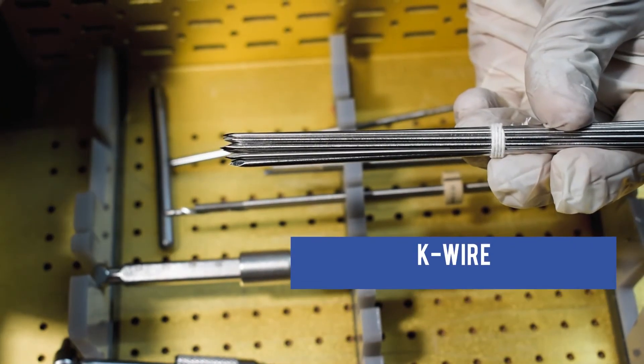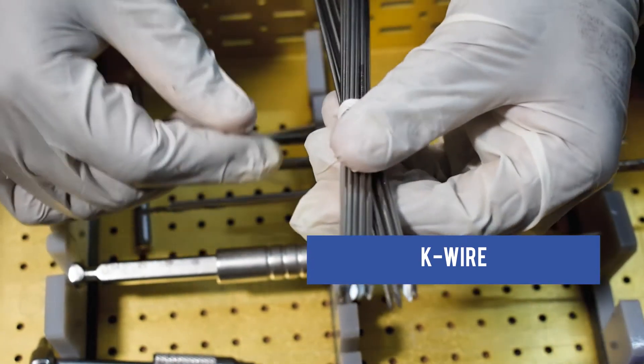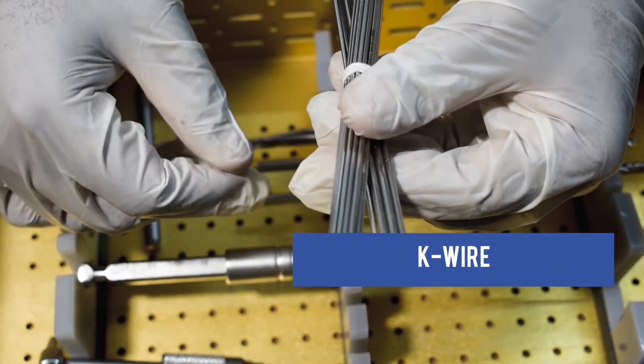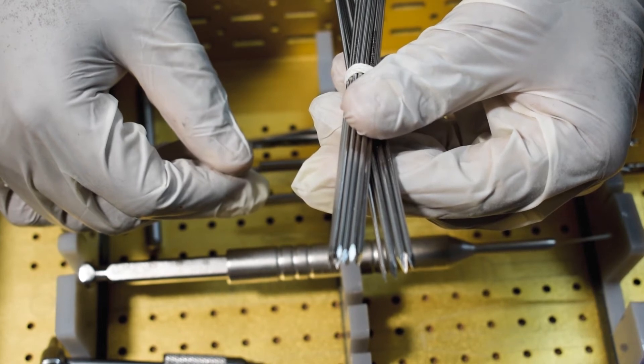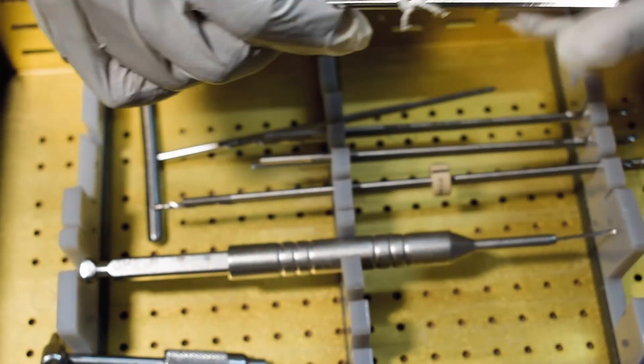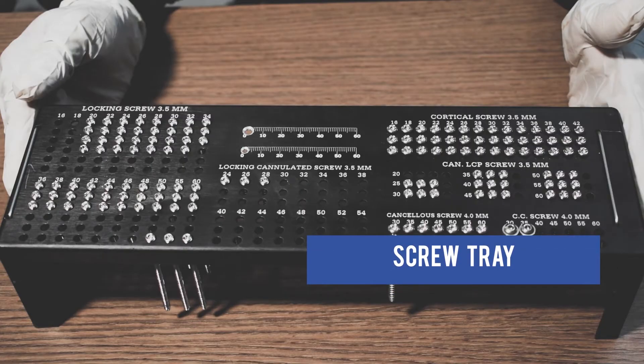This is a 2.5mm 9-inch Drill Bit. This is K-wire in multiple sizes: 1.2mm, 1.5mm, 1.5mm, 1.8mm, 2.5mm, and 2.5mm. This is Screw Tray.